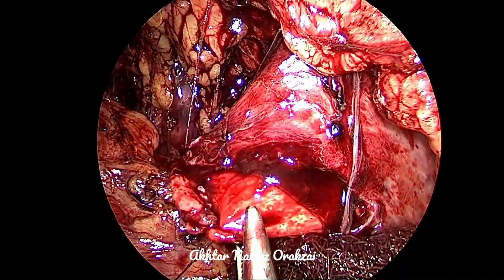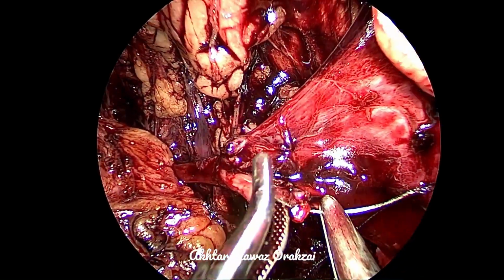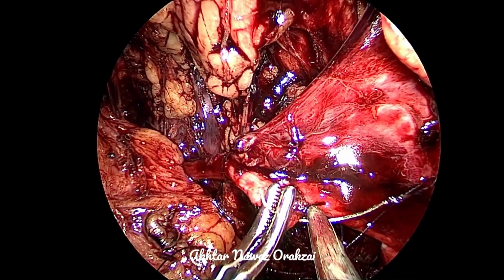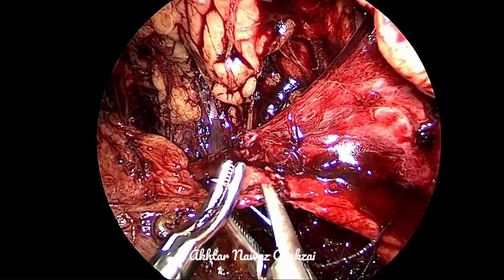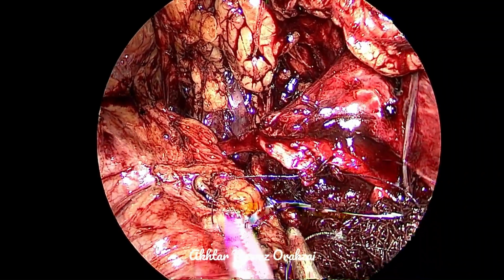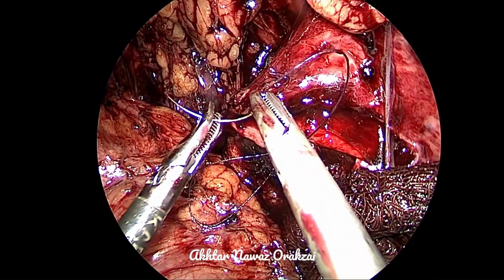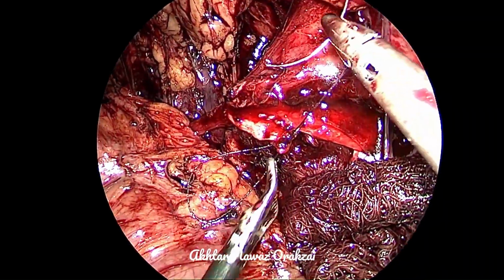Here you can see that we have taken the suture out, and now we will create a loop outside the anastomosis, and then we will take another stitch, so the suture will be outside the anastomosis, and hence the knot will be outside the anastomosis.